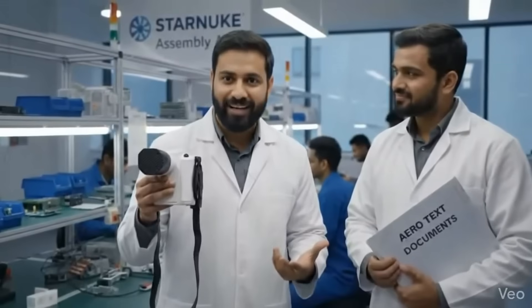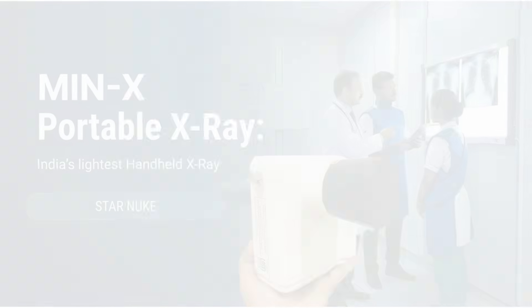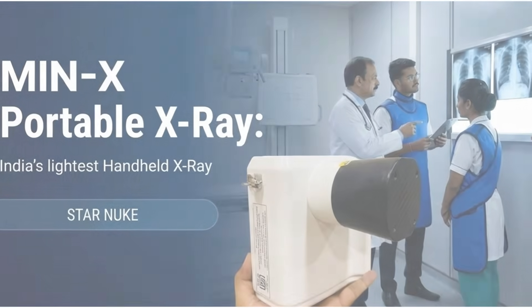Do you know which X-ray machine is truly made in India and how it works? Let's find out. Introducing the MIN-X portable X-ray — India's lightest handheld X-ray device from StarNuke.